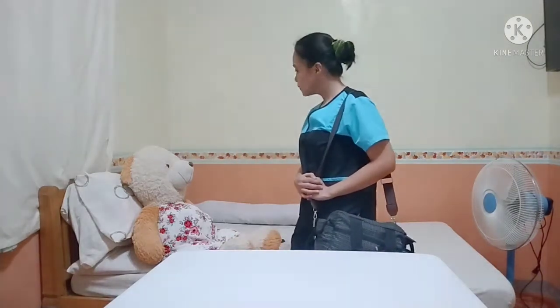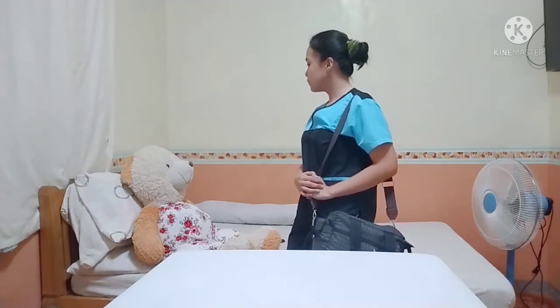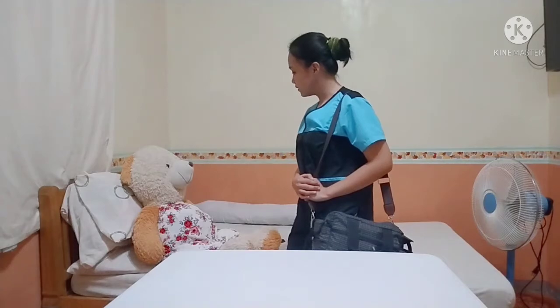So, Ma'am Ann, nandito po ulit ako sa inyo para naman po i-test yung ihi niyo po. Titignan lang po natin kung may kitang sugar po sa ihi niyo at matignan po natin kung nasa magandang condition po kayo. Okay na po ba sa inyo yun?